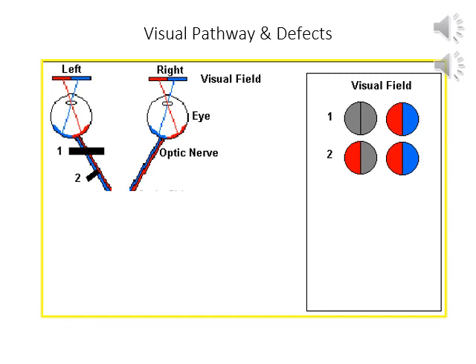And then also on the right eye, there's no lesion anywhere, and so we see the full red and blue stimulation going through. Lesions of either temporal fields of either eye will show the same pattern of results, except that in one eye it'll be on the left, and in the other eye it'll be on the right.